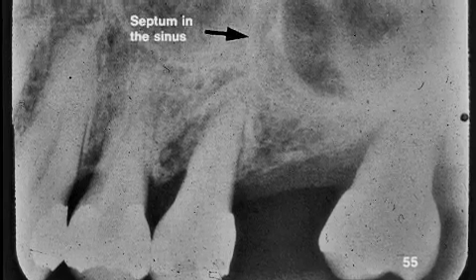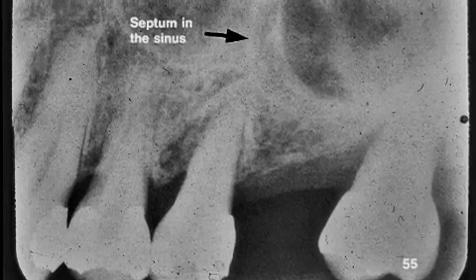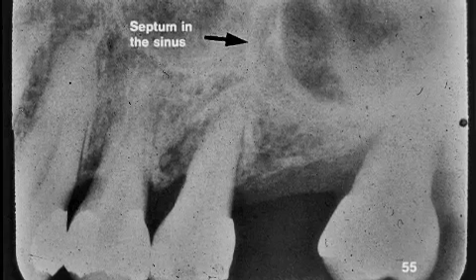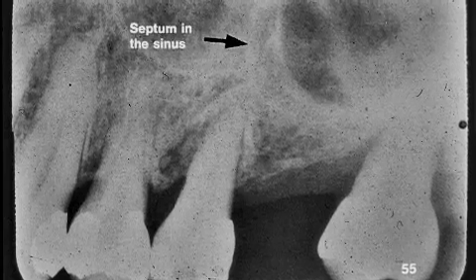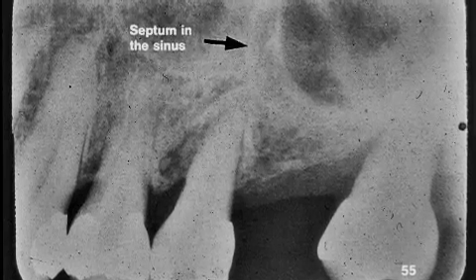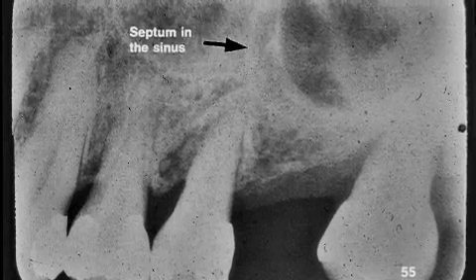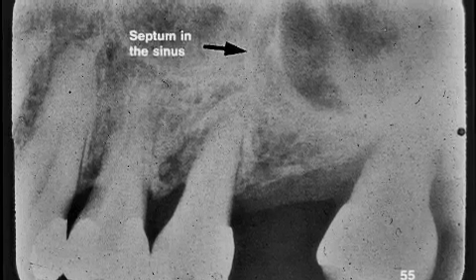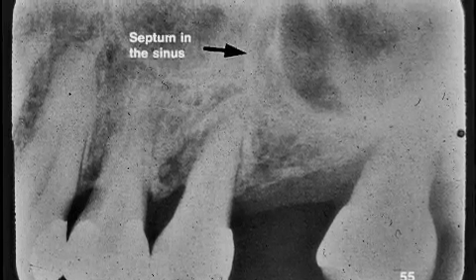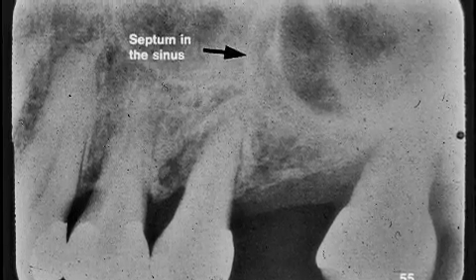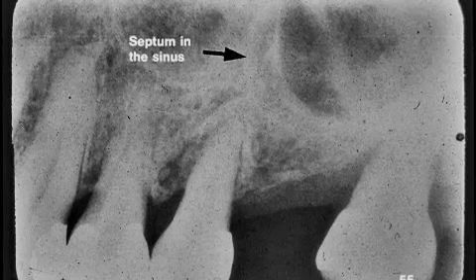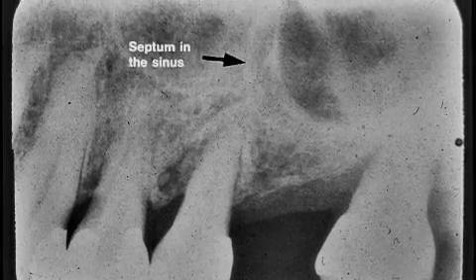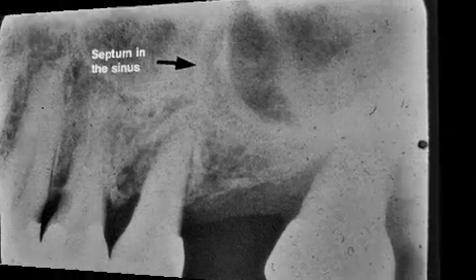In the maxillary posterior region, sometimes we see septa in the sinus. There can be more than one, or there can be none. They are radiopaque and extend vertically in the sinus. They are partitions of bone.